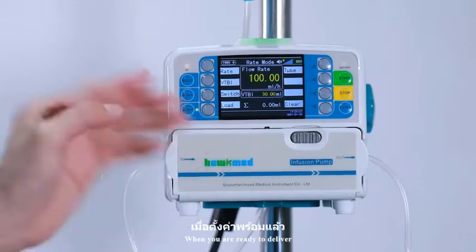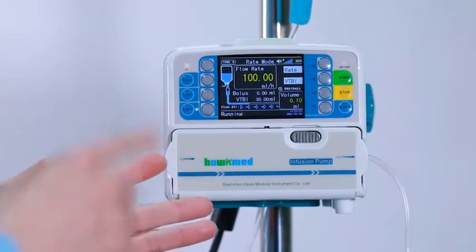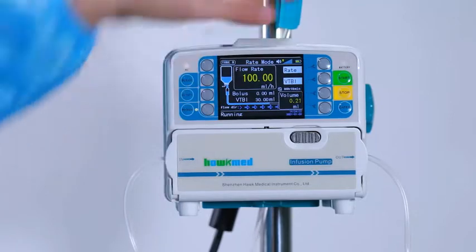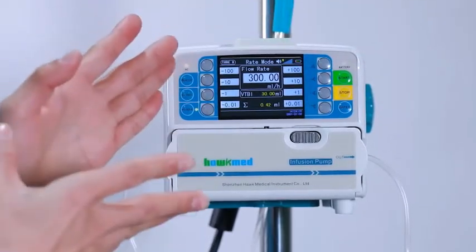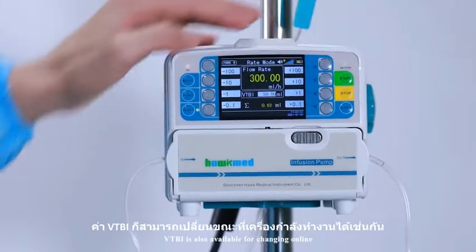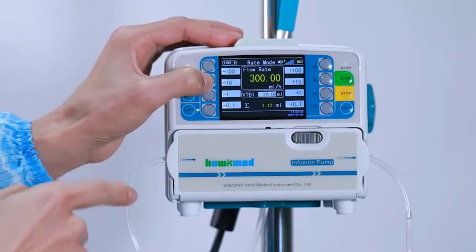When you are ready to deliver, simply press start. We can always use titration if you would like to change the flow rate — you can change it while it is still running. VTBI is also available for changing online. Press enter.